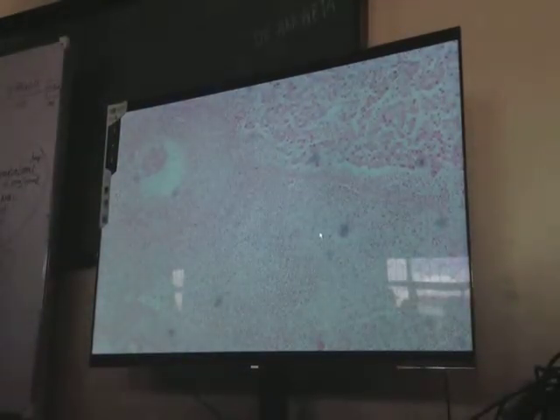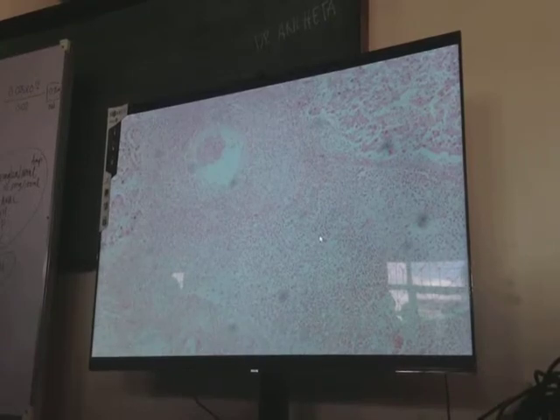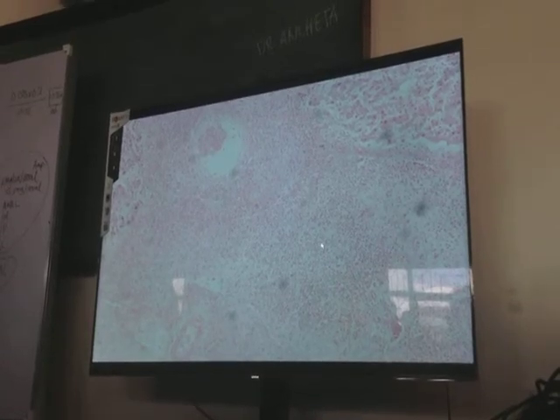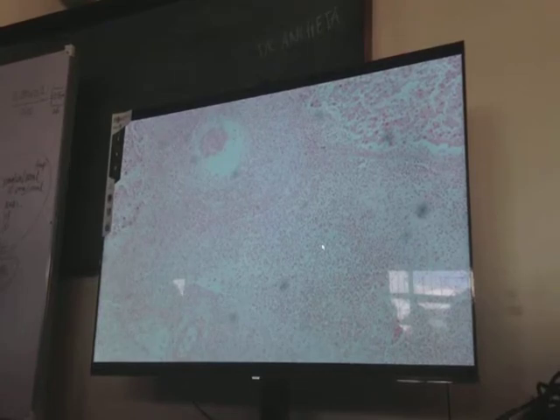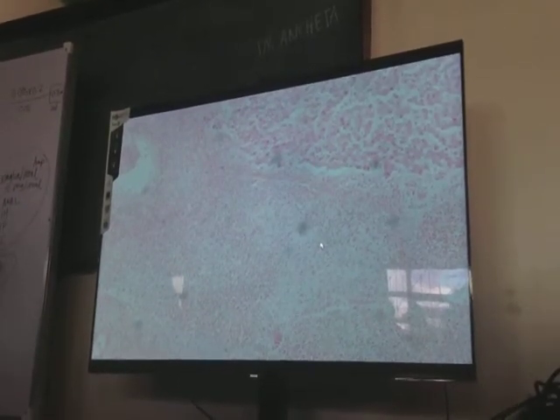Polymorphonuclear or mononuclear? Mononuclear. Now, unfortunately, this slide is labeled as liver abscess. Okay, so what cells should you expect to see in a pus or an abscess? Neutrophils. So let us not include this one, you might get confused.